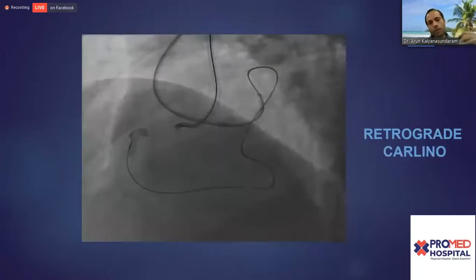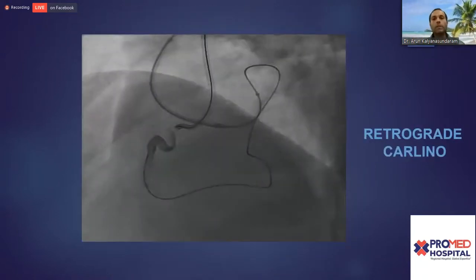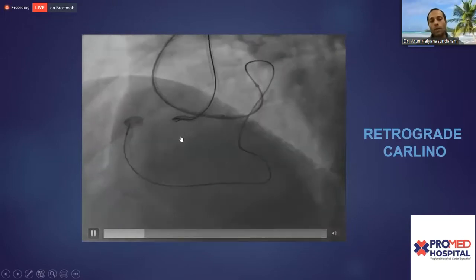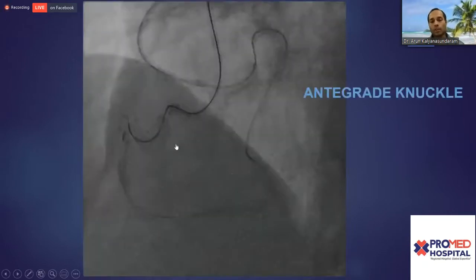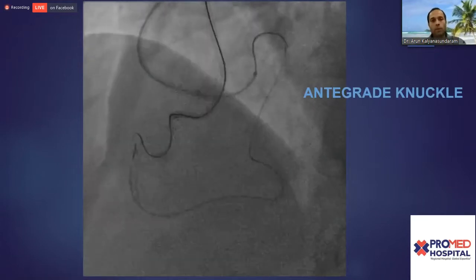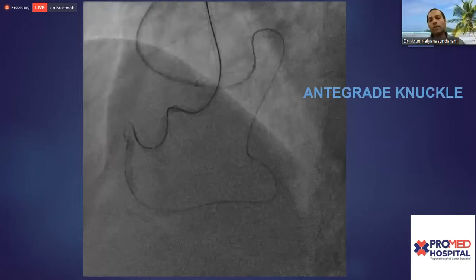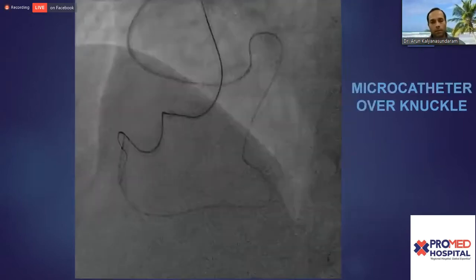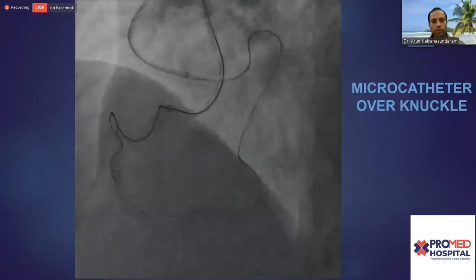So this is where I actually did what we call a Carlino. Again, that's the course of the vessel, right? And now I'm in the game. Now the knuckle actually was going in the right way. So I got an antegrade knuckle, followed up with a microcatheter. I already have a retrograde microcatheter. And now it's essentially a guide extension reverse CART.